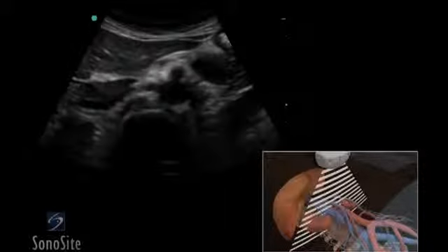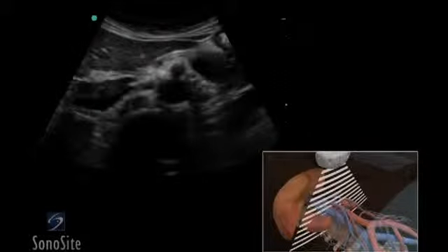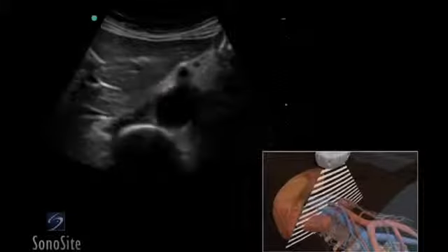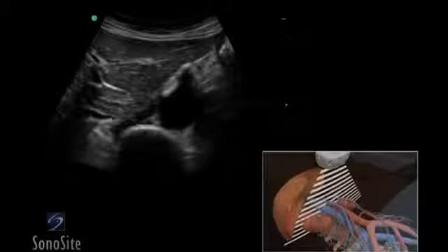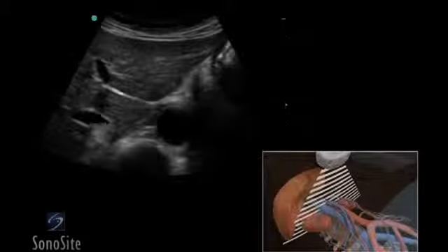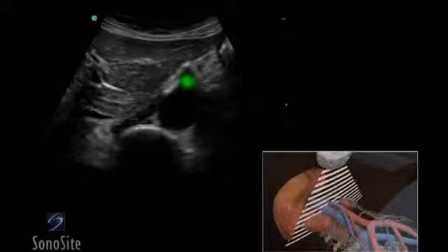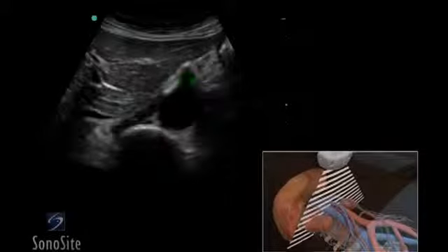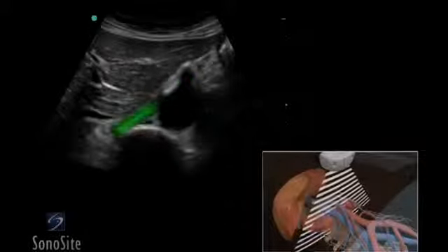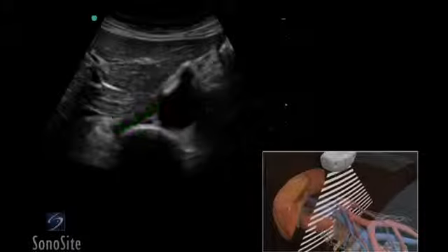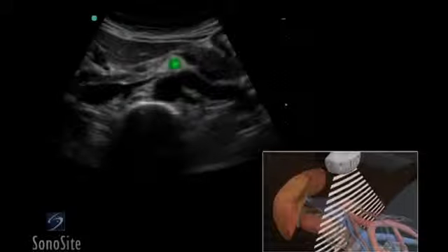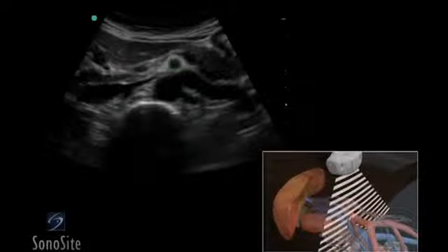The abdominal aorta will course gradually, becoming more superficial as it progresses distally. The transducer is slowly moved distally to identify the celiac trunk, renal arteries, and superior mesenteric artery.